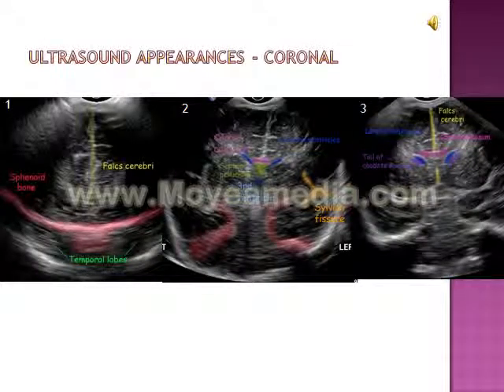The following pictures highlight important neonatal brain anatomy. When we begin coronal imaging through the frontal lobes, the orbital ridge forms the inferior boundary of the image. As the transducer is angled back, the cerebrospinal fluid in the lateral ventricles results in these dark structures. The lateral ventricles are larger in preterm infants than in term infants. Asymmetry between the lateral ventricles should be noted, but is not always abnormal.